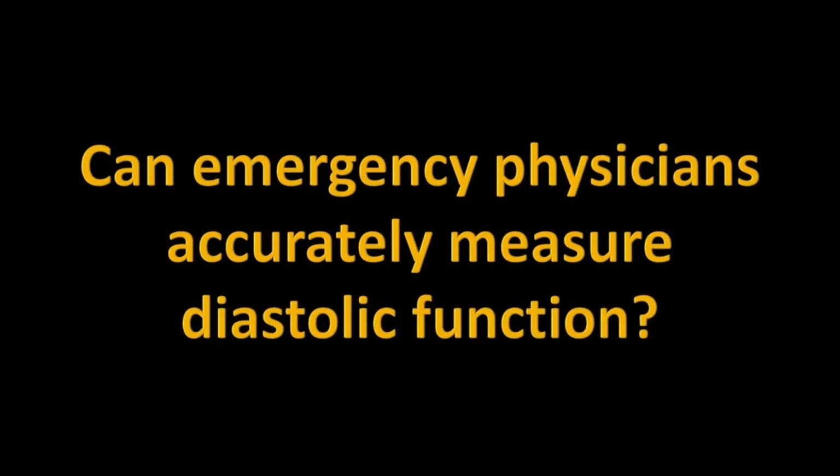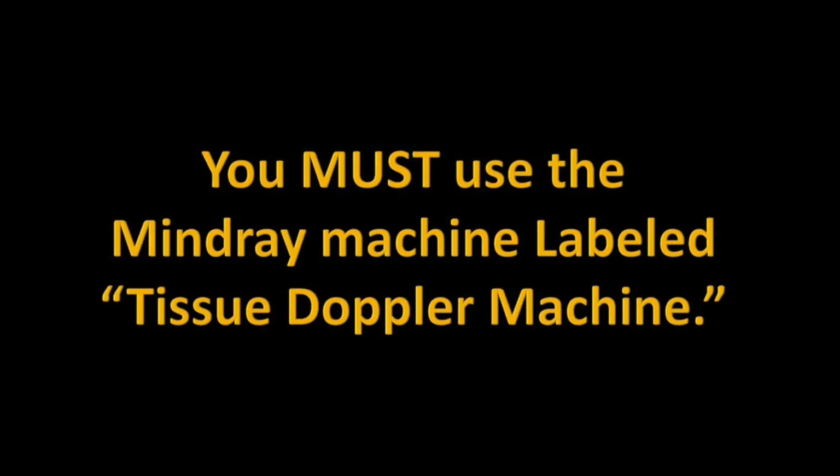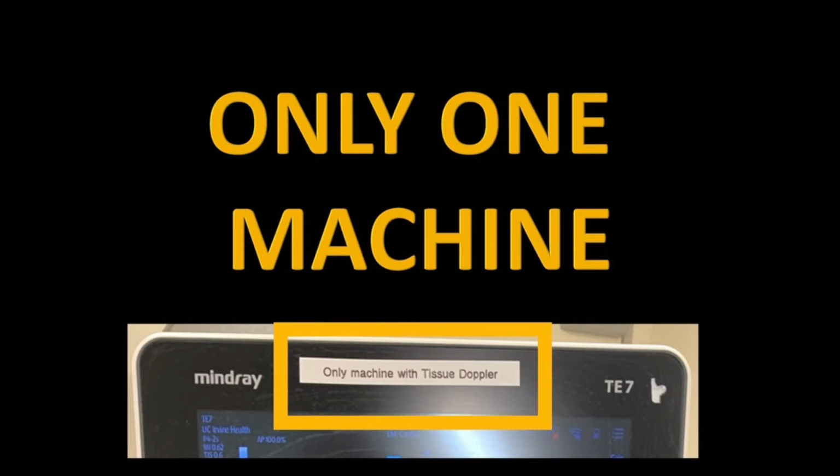In this study, we are determining whether emergency physicians can adequately measure diastolic function. You will need to use the Mindray ultrasound machine that is labeled as the tissue Doppler machine. We only have one machine in the emergency department that is capable of performing this study.